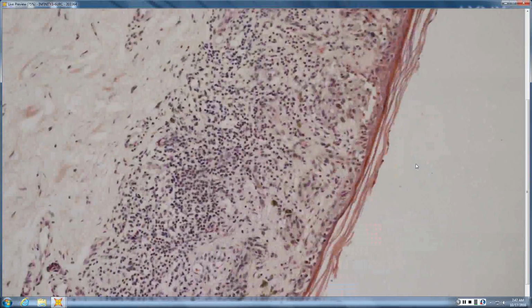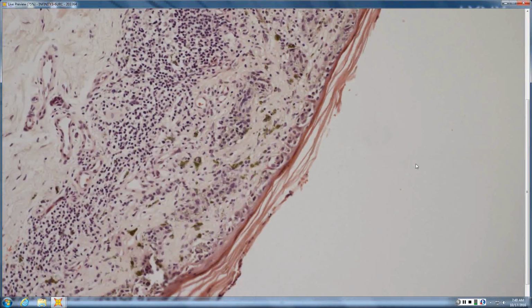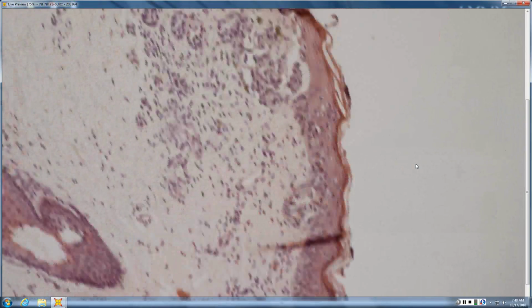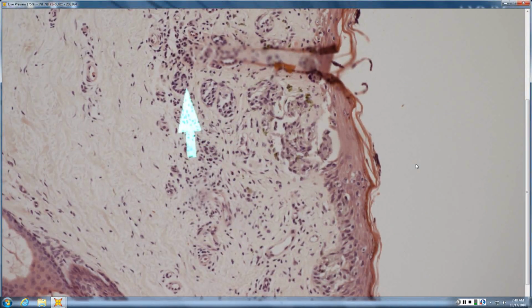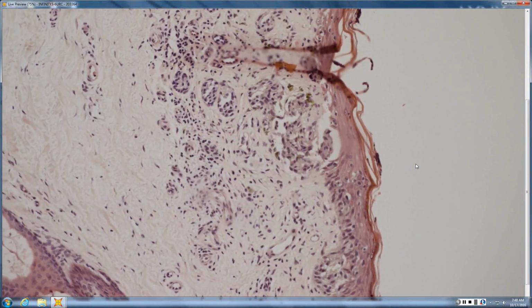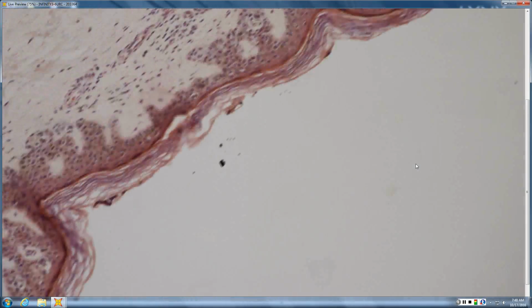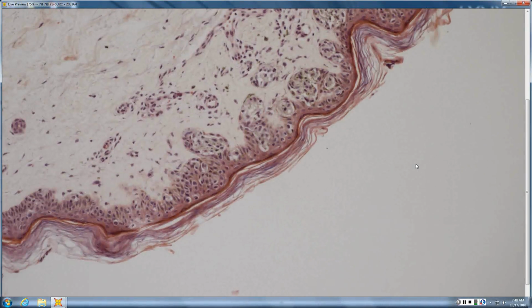And there's definitely some interface inflammation. Junctional confluence, consumption of the epidermis almost up to the corneum. So is this MIS? So MIS, and then how about these nests here? Do you see any evidence of maturation or dispersion in those nests? No. So then invasive. Yes, it's invasive. So the MIS, which is overlying, catches your eye, but then those dermal nests were also an invasive focus.